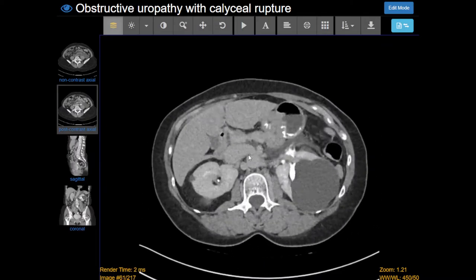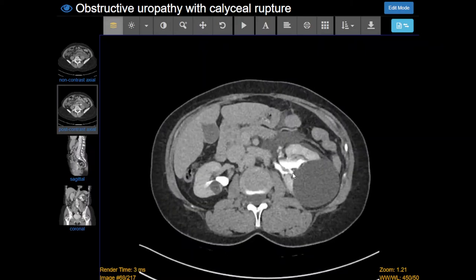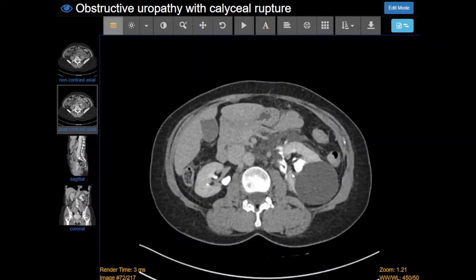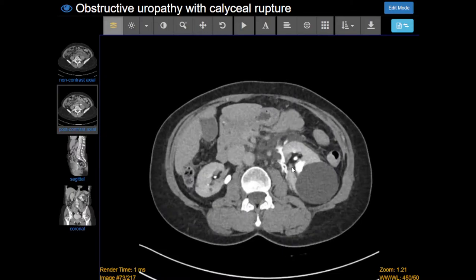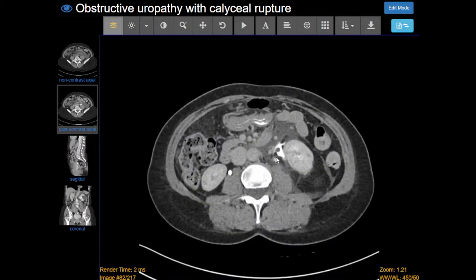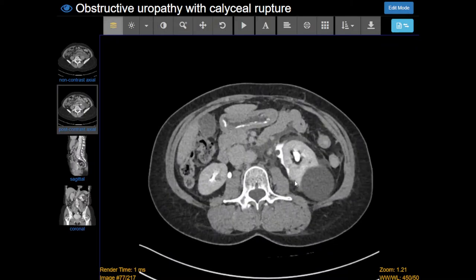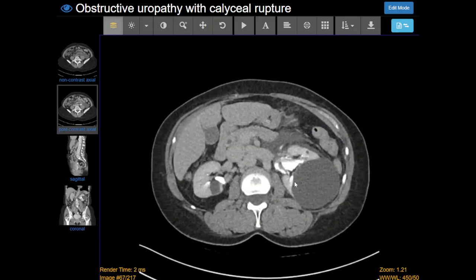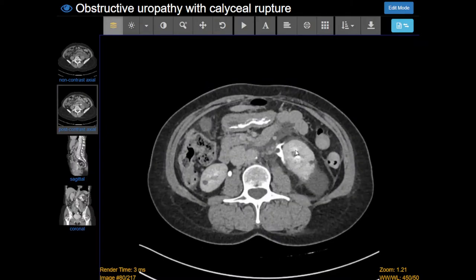If we focus on our left side, here's the left kidney — there's contrast in the collecting system, but it starts to have this bizarre appearance. You see contrast in the urine, but then there's other fluid, and if you follow down the ureter, you don't see any contrast in the ureter itself. In fact, all the contrast is outside and surrounding the ureter. This confirms our diagnosis of a caliceal rupture — the collecting system has effectively ruptured, and urine has spilled into the abdomen.